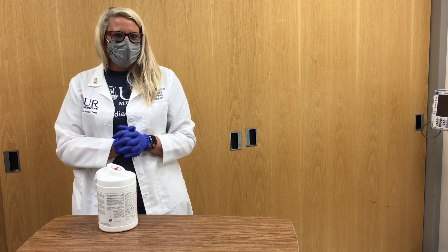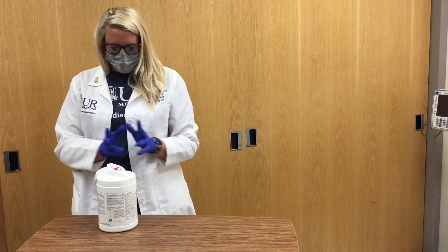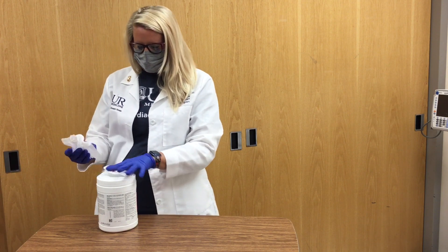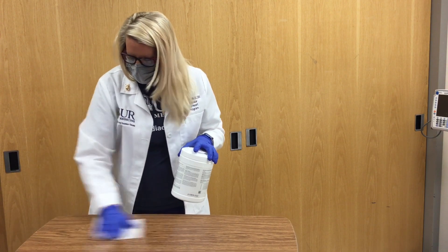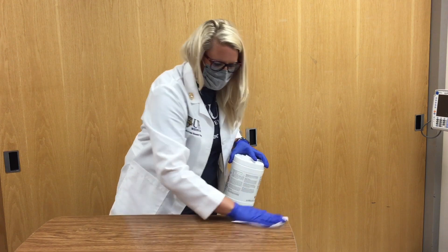Have the patient lay down in a comfortable place where you can easily access the driveline. You are then going to clean off the bedside table with an antimicrobial wipe, allowed to air dry. While the table is drying, wash your hands with soap and water for 30 seconds.